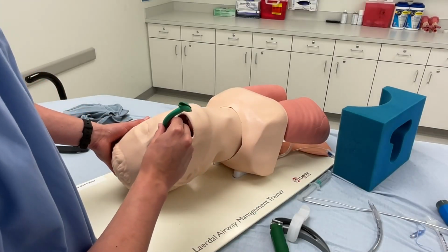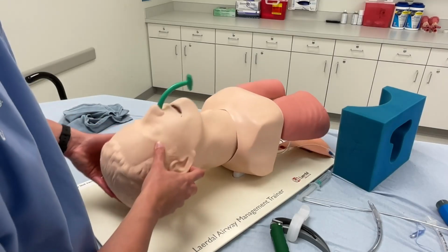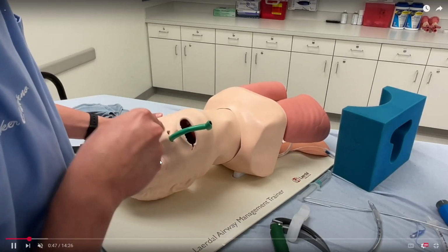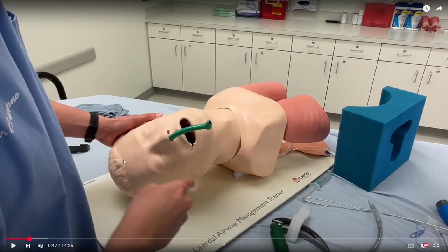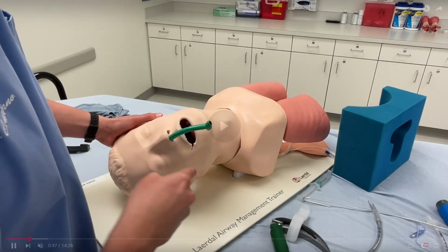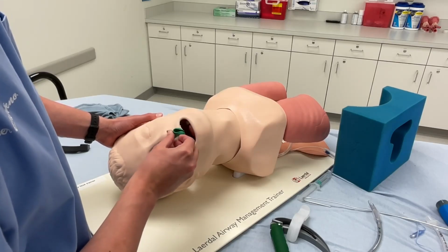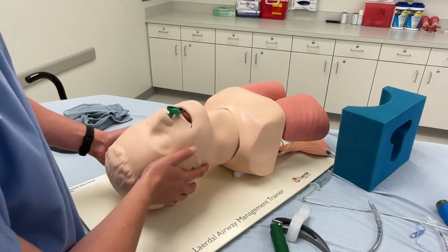so starting out by pushing into the nasal cavity, and as my finger is going to indicate, you want to push straight down. You don't want to be pushing up towards the forehead. You want to be pushing down, basically in towards the ear along that axis. On this mannequin, I don't really have a choice. Again, it's just plastic, so I have to insert where it goes. And there it is inserted.